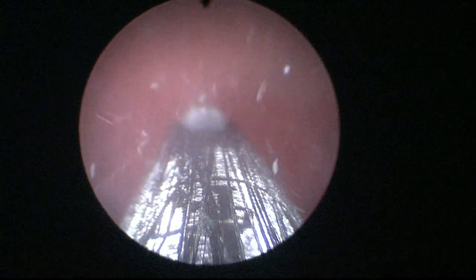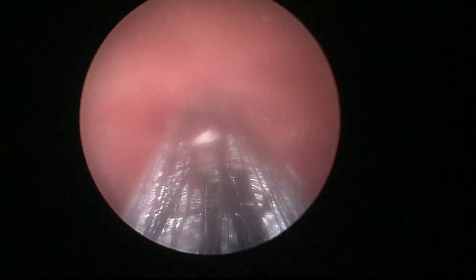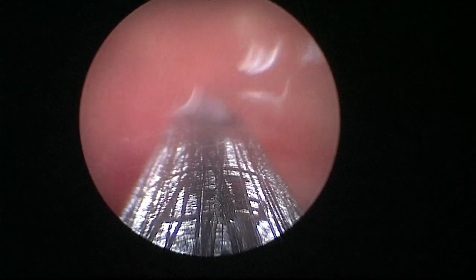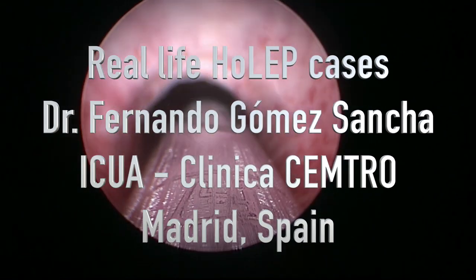And there we are, that's the end of it. And this is the end of the operation. Let's see, there's a piece here. It's a small piece, but it could obstruct the catheter. And there we go. You see, there's no anterior tissue. We just respected the sphincter.